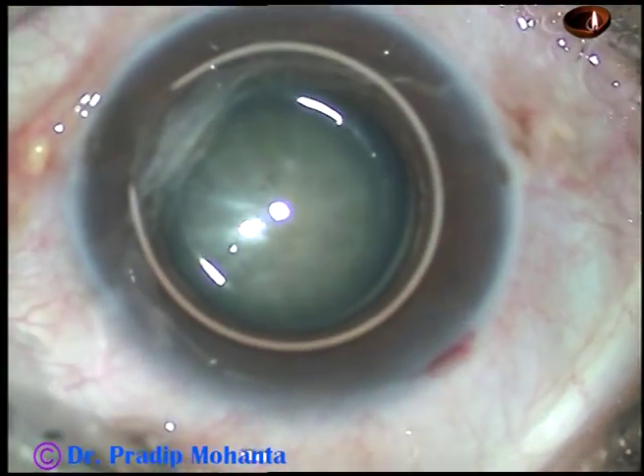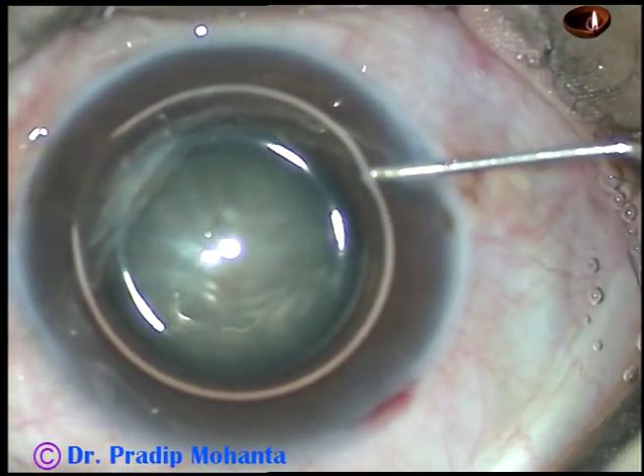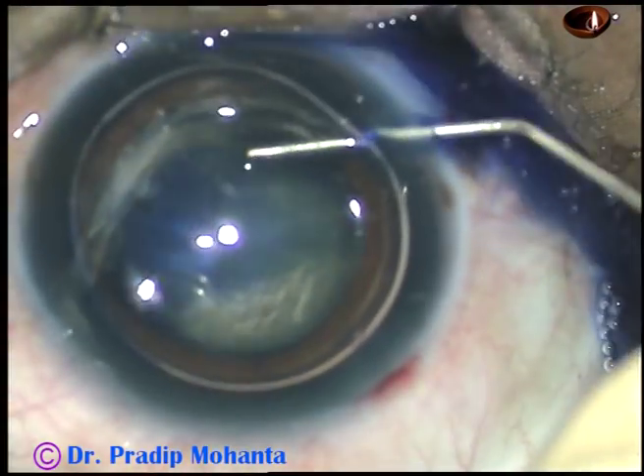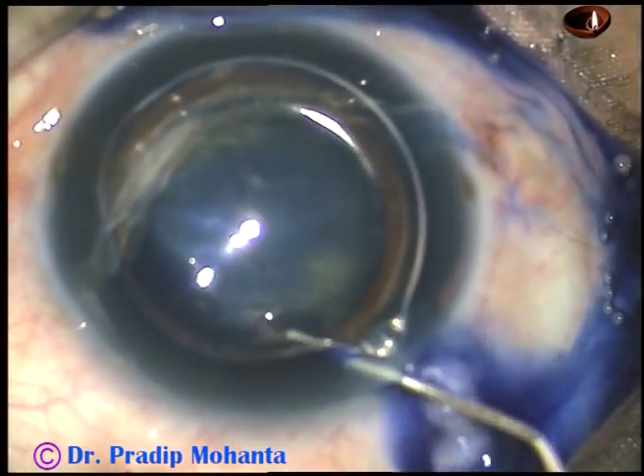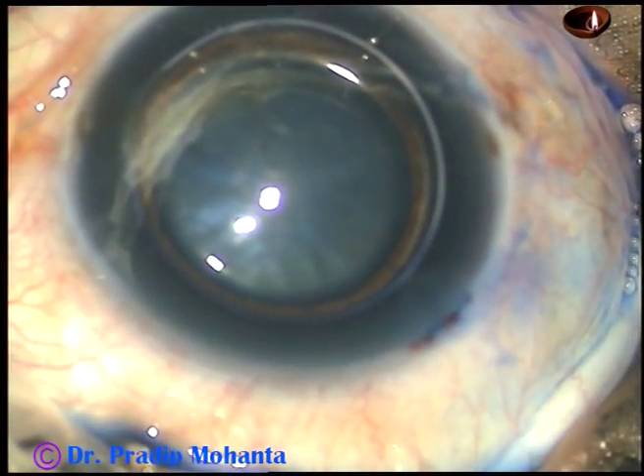By this time, the main incision and side port on the right side of the main incision has been made. At this time, the anterior capsule is being stained with trypan blue dye underneath an air bubble.